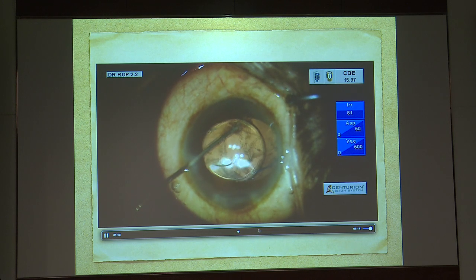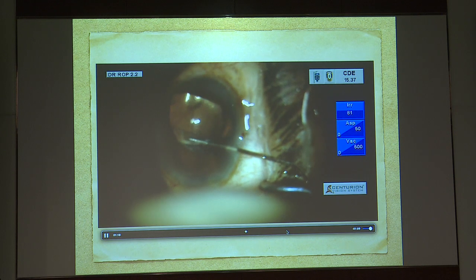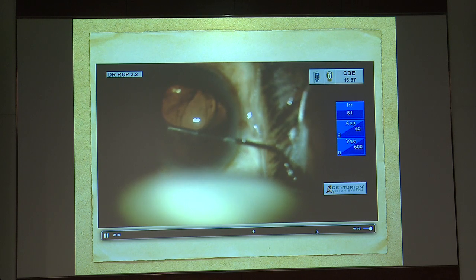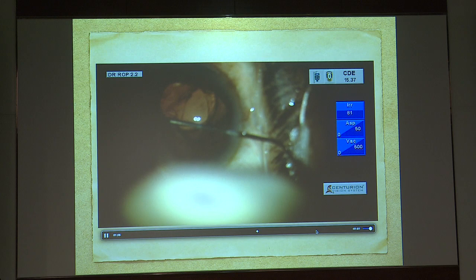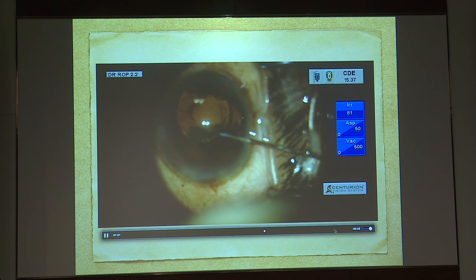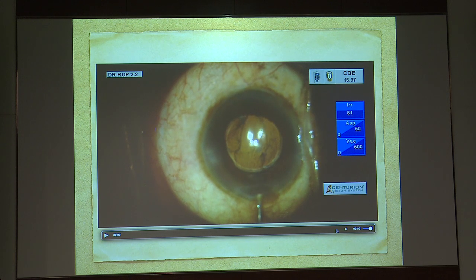Rest of the cortical matter could be removed using a dry aspiration, or you can use a cutter or a vitrectomy cutter with which you can remove. Ideally, we have to put triamcinolone acetate to find if there are any vitreous strands. This was not done in this case, but using an IOL scaffold, a PCR could be managed very well. The take-home message is that when PCR occurs during emulsification, using an IOL scaffold can provide a very safe technique. Thank you.